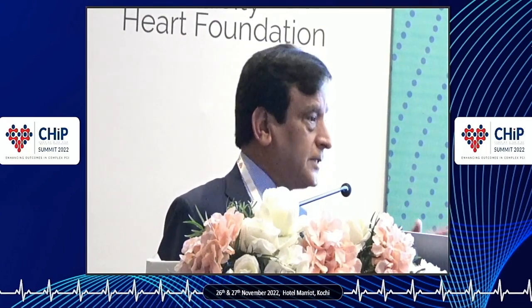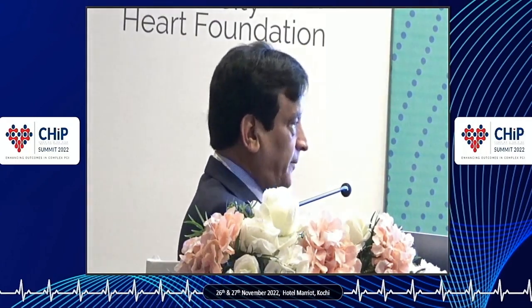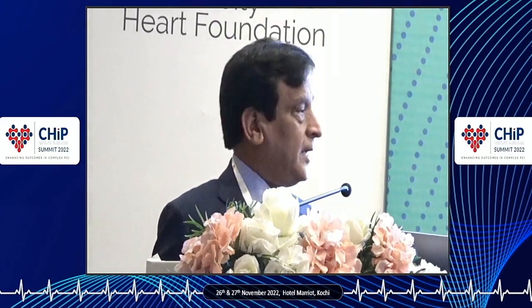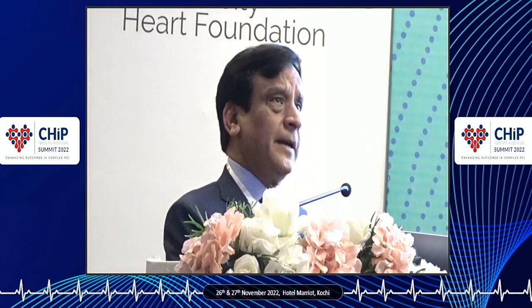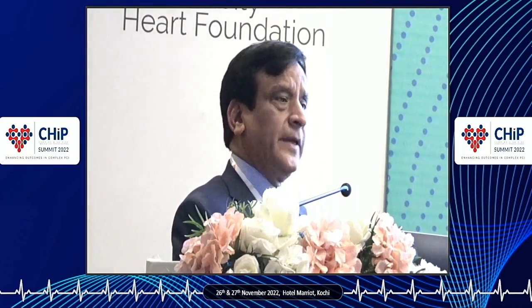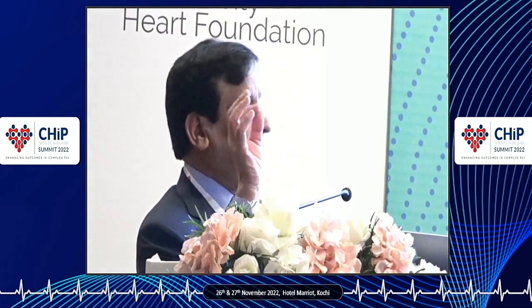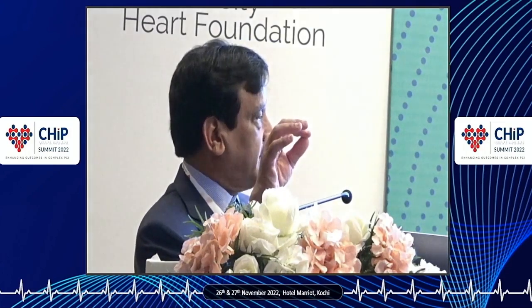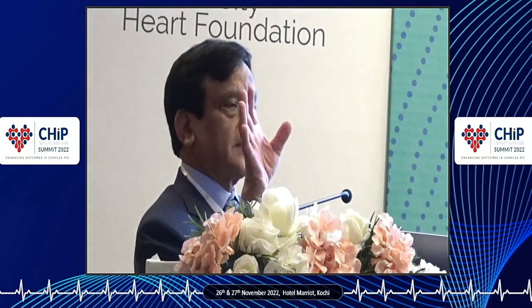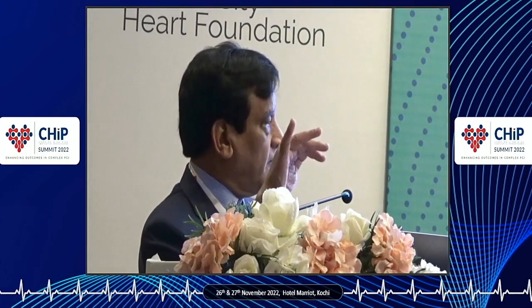Now, what else can you do if you don't want to put in a pacemaker? Many of us work from the radial, and putting in a pacemaker is difficult, as you have to go to the groin. Use aminophylline. We published back in 1996-97 that you can avoid a pacemaker by giving 5 milligram per kilogram of aminophylline, 300 milligram, with 1 milligram atropine before you start the atherectomy. With the radial, that cocktail works very well. So 300 milligram IV aminophylline and 1 milligram atropine will be, I would say, a poor man's temporary pacemaker.